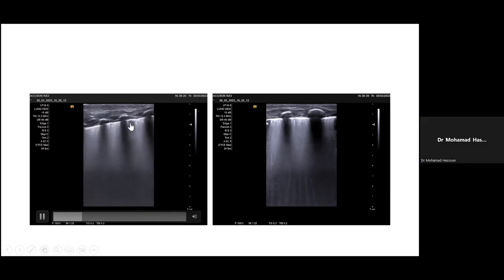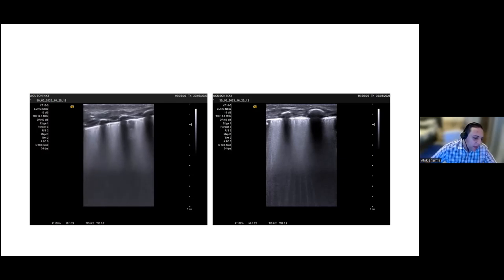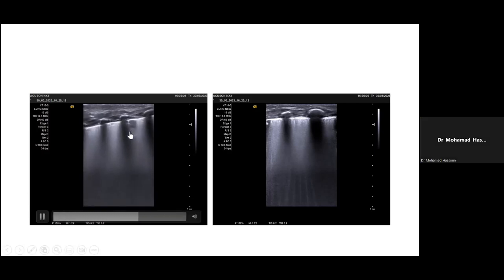Again, it could be a small area of atelectasis below the level of the pleura, but sufficient enough to aerate to produce the pleural line. That's the only thing I can think. The other possibility is it's artifact. The only reason I say it might be artifact or a consolidation is just the horizontal nature of your probe. So if it's just slightly sloping, the points in favor of a consolidation, if you look just below it, take your arrow just below it. Yeah, that area looks a little bit dense.